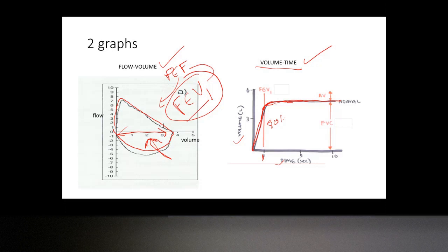So basically, the machine is collecting one dot every millisecond or something, so you actually measure the dots. Wow, you remember. So based on that, you can calculate FEV1.